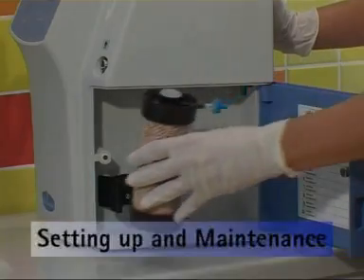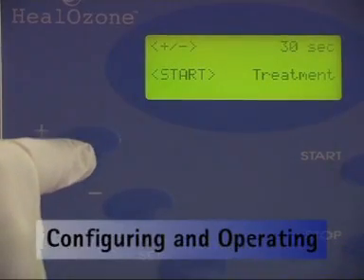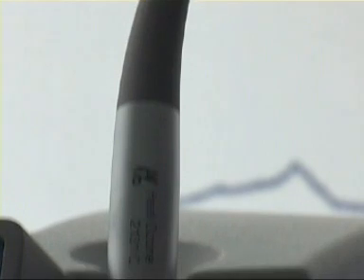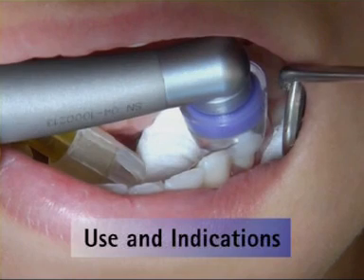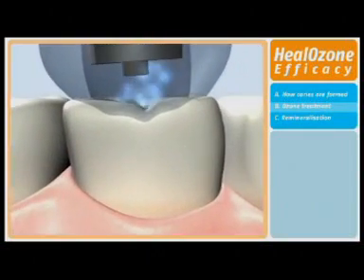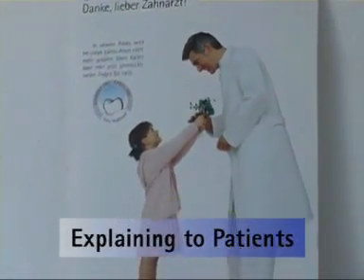On this CD we are going to show you: first, how to set up your new HeloZone unit quickly and easily; second, how to configure and operate the unit; third, how to use Kevo HeloZone to treat patients; fourth, ozone as a chemical reaction; and fifth, how you can explain it to your patients.